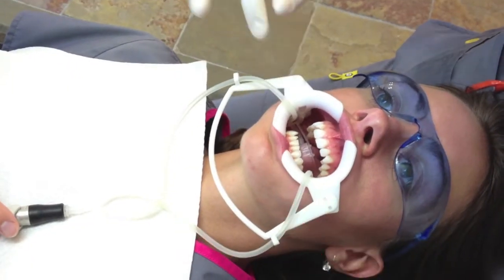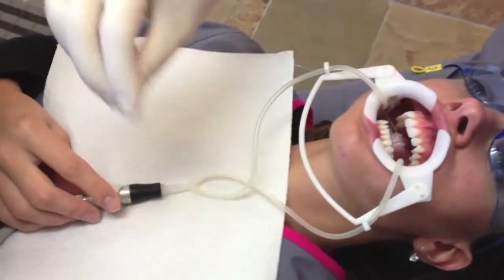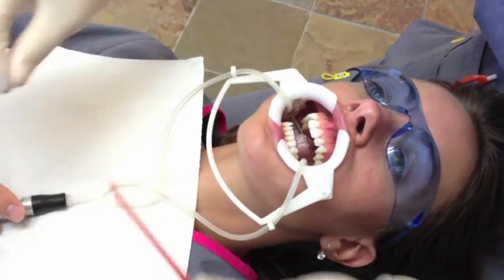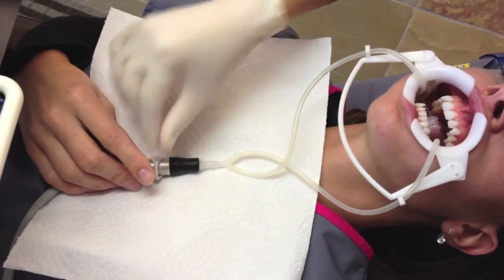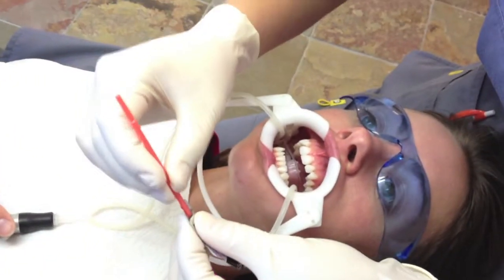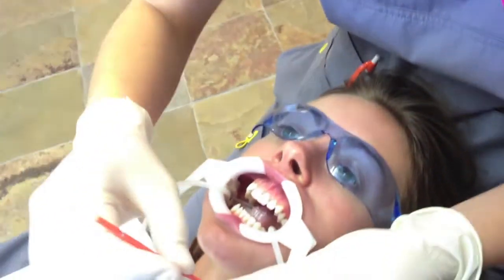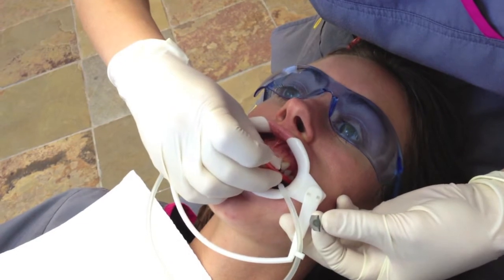So we're getting ready for Susan to start me out and we'll see how things go. We put our cheek retractors in and our little tongue piece that's connected to the saliva ejector to keep everything dry, so she can control the lever — if it gets too much she can turn it down or turn it up. Then we cleaned up the teeth with our first conditioner and we're using our primer.